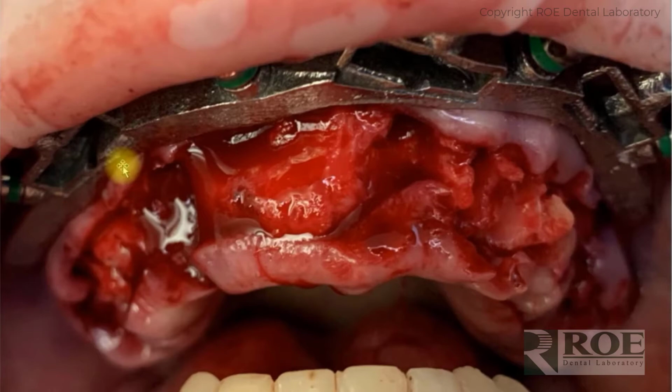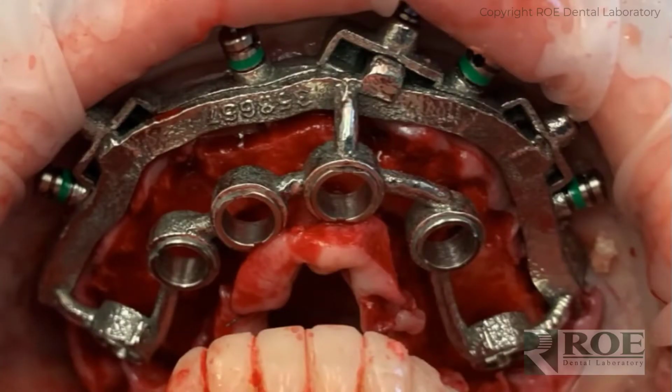The other contraindication could be there could be stitches that are right at the junction of the tissue and the prosthetic. But again, this is a nice technique to minimize the flapping, because unlike plastic guides, chrome has a very, very small footprint and requires much less flapping, much less aggressive flapping techniques, especially on the lingual, on the palatal side. So it's a nice technique.